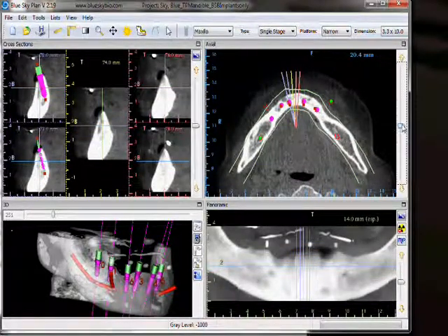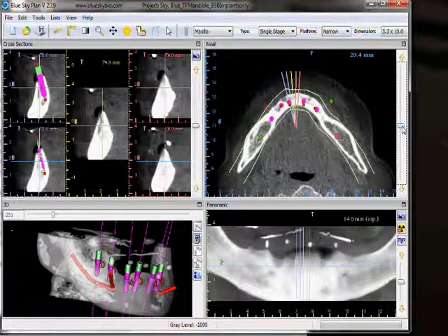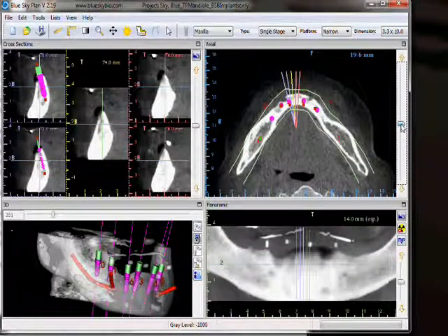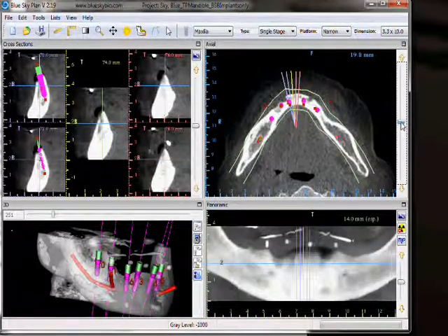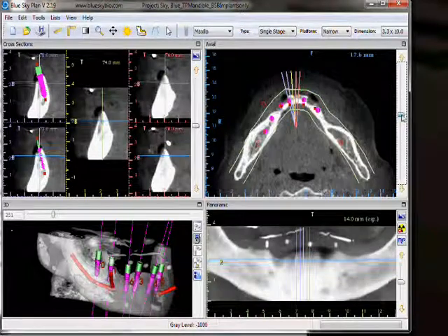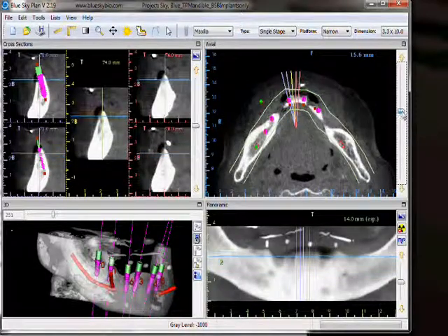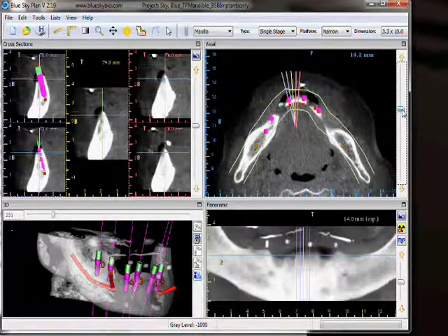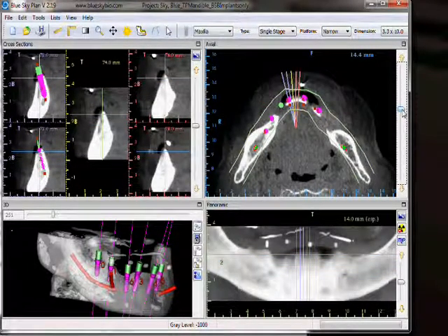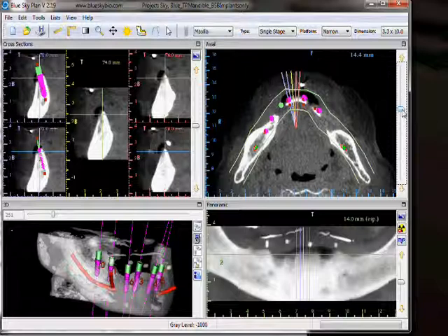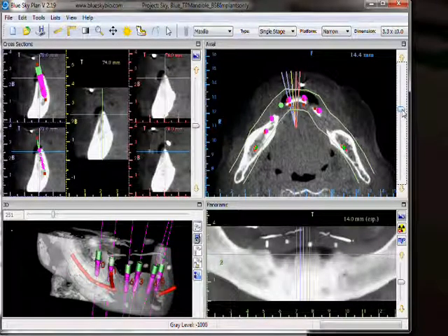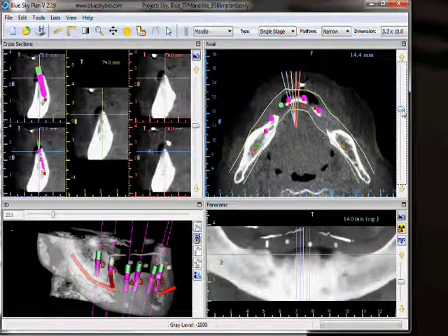Please note that as we flip through these slices, the blue horizontal line in our cross-sections and panoramic view moves accordingly, indicating on a vertical plane the exact location of our horizontal axial slice.